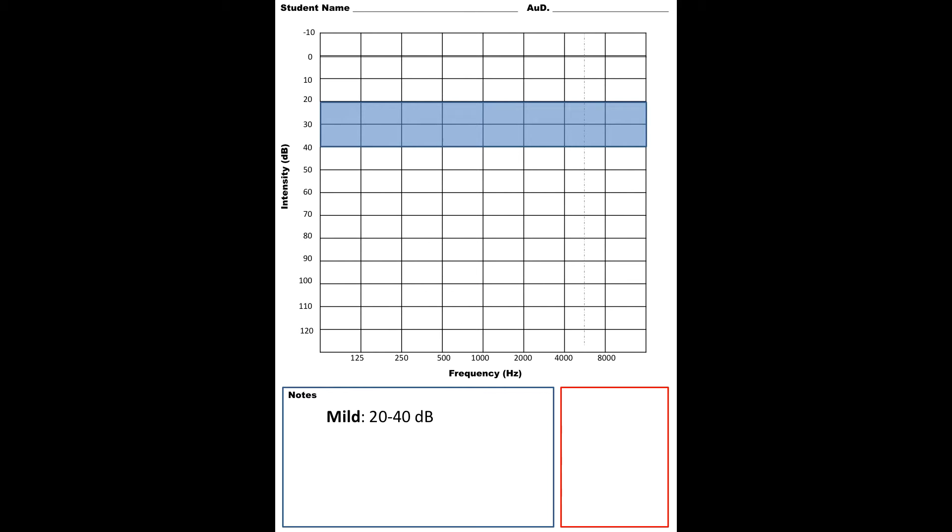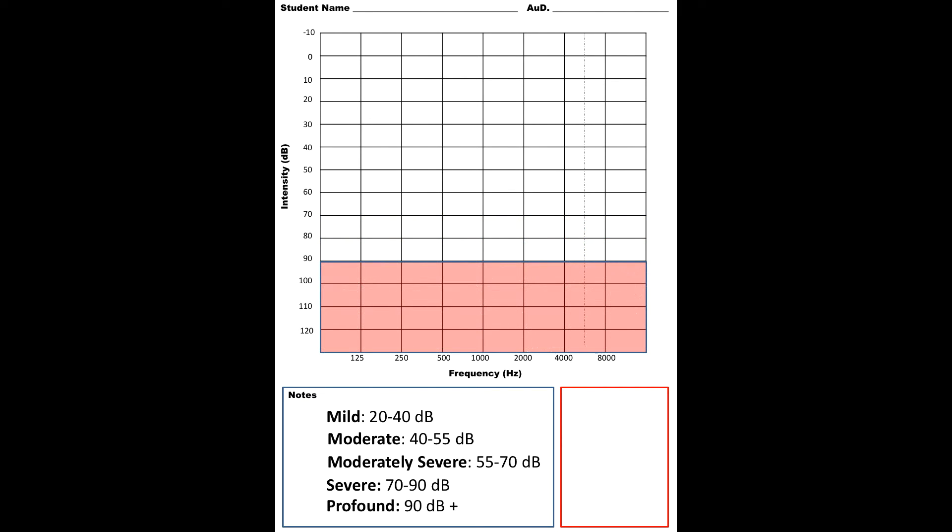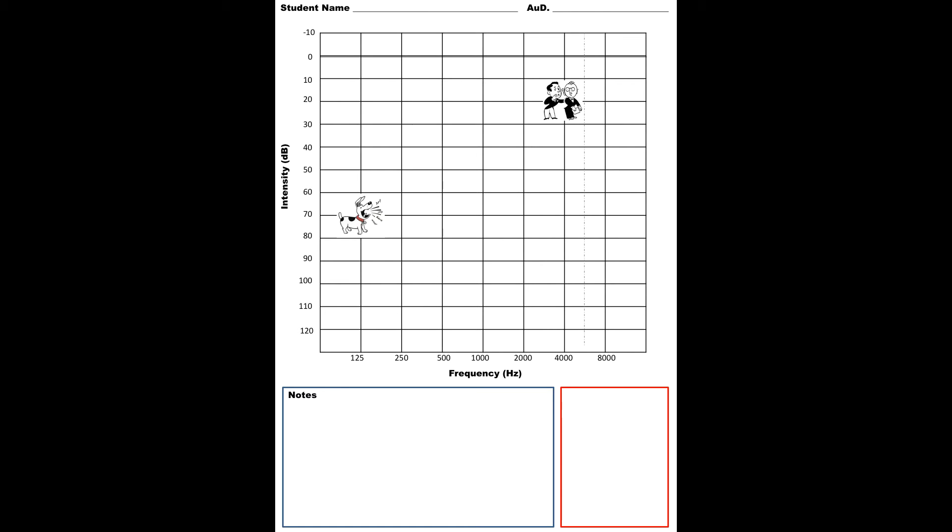I wanted to go over the degrees of hearing loss pretty briefly so you can see it represented on an audiogram. A mild hearing loss is going to be between 20 and 40 decibel levels. A moderate hearing loss will be between 40 and 55 decibels. A moderately severe hearing loss will be between 55 and 70. A severe hearing loss is between 70 and 90. And finally, a profound hearing loss will be 90 and above. As you can see on the audiogram, as the degree of hearing loss becomes more severe, it goes down on the audiogram.